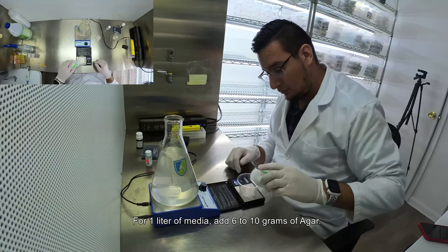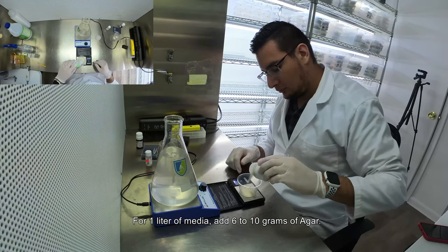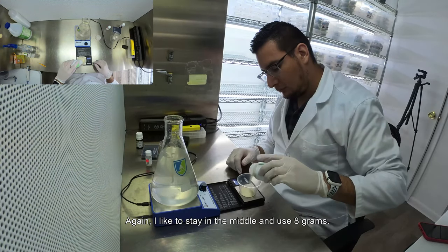For one liter of media, add six to ten grams of agar. I'd like to stay in the middle and use eight grams.